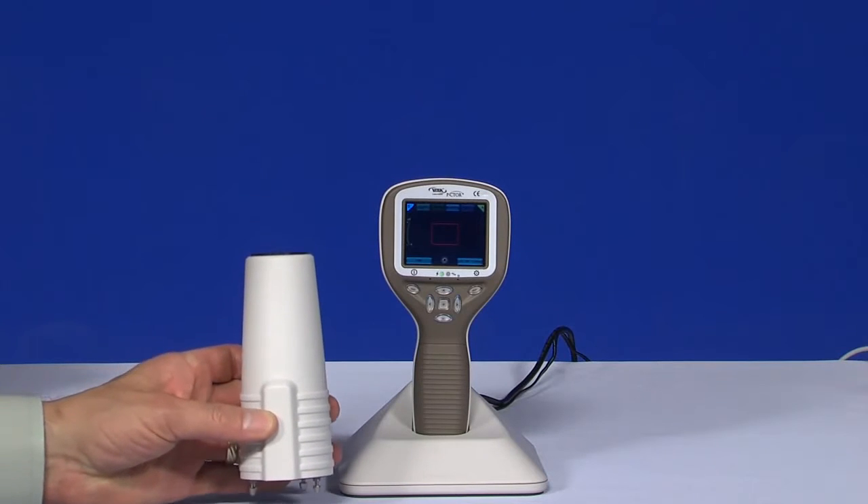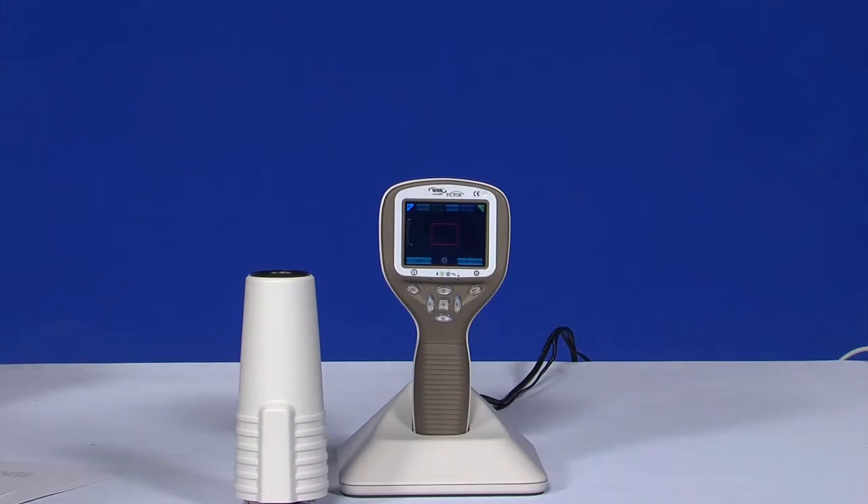The retinal module is intended for non-mydriatic imaging. Infrared light is used for targeting the eye fundus, and white light is flashed when the image is taken. The pupil does not respond to the infrared light, so the examination is convenient for the patient.